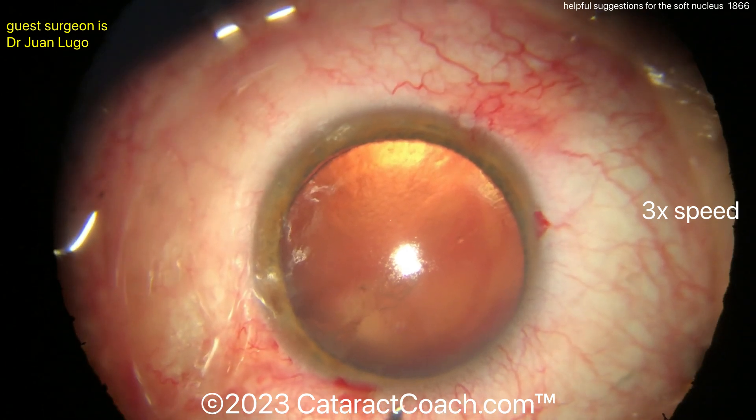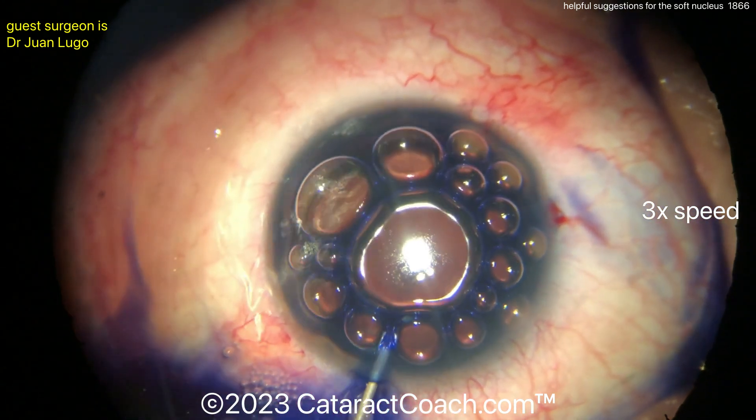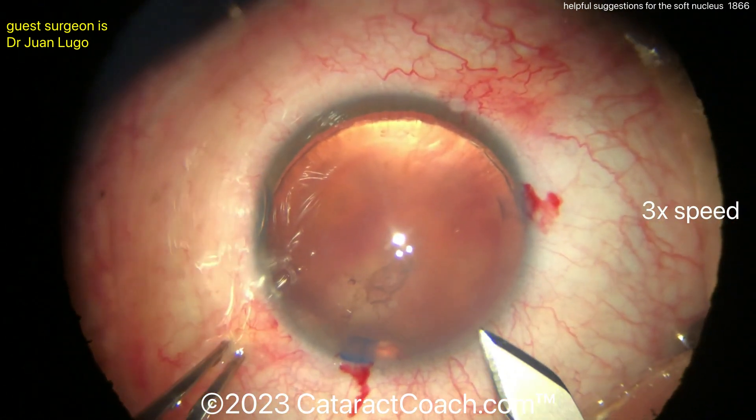So two paracentesis incisions, and filling up the eye with blue dye. I don't know if you really need blue dye in this case — it's such a great red reflex. It's a very soft lens, but displacing that out with some viscoelastic. I like those two incisions so far.